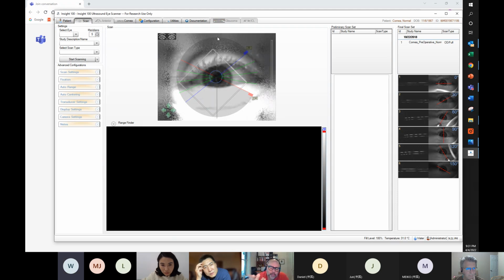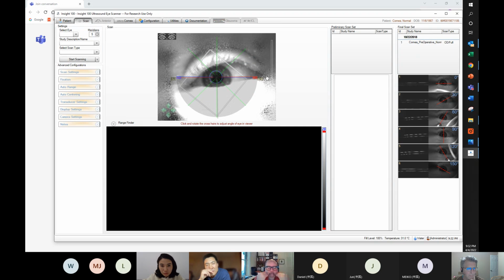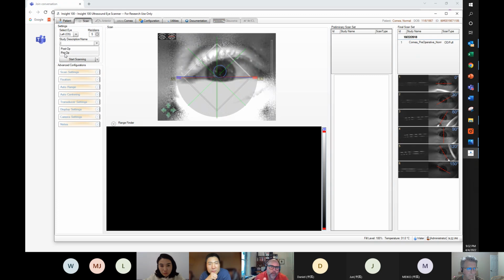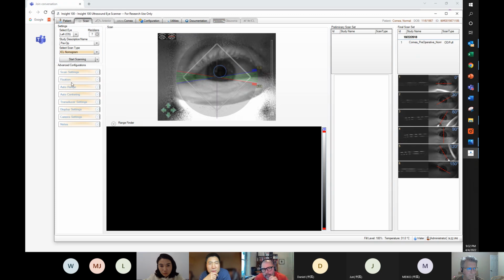But if you want to do an epithelial mapping, it will defeat the purpose, because usually, and I say usually because I had a case of an atypical keratoconus last week, the keratoconus is on the lower side. If you do what Barry did, side to side like a bow tie, you don't measure the top and the bottom. You cannot use that for keratoconus, but you can for ICLs.